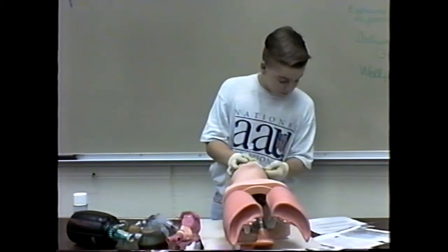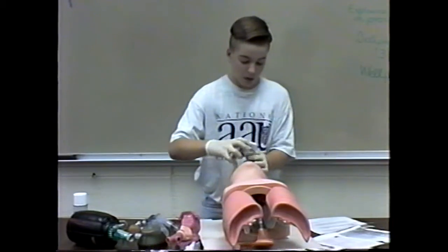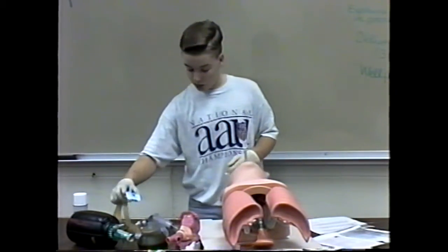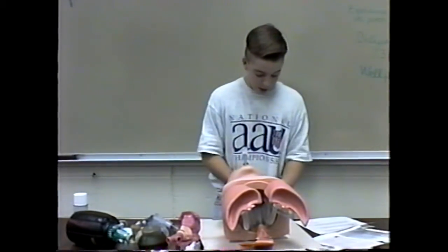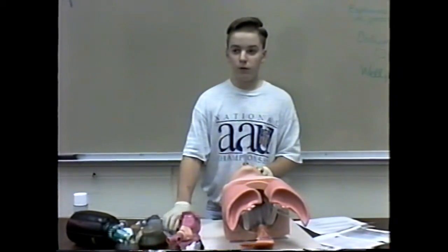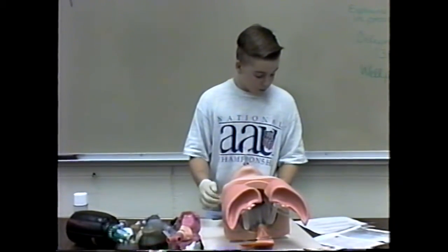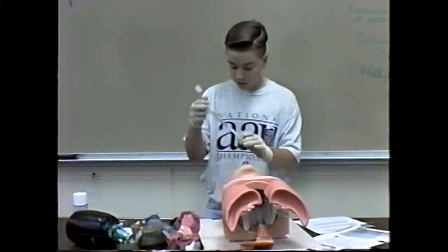Intubation is very important to saving lives in today's system. Intubation can also be used by giving medications to the patient, which I covered. The Norwalk Fire and Rescue Unit is certified as a conditional paramedic. I think we have 4 or 5 paramedics, and they can use this procedure in saving lives today.